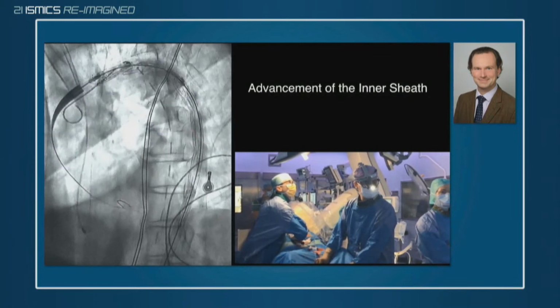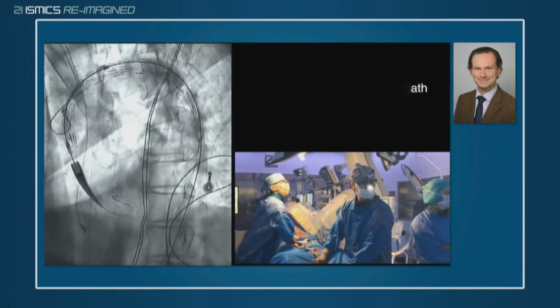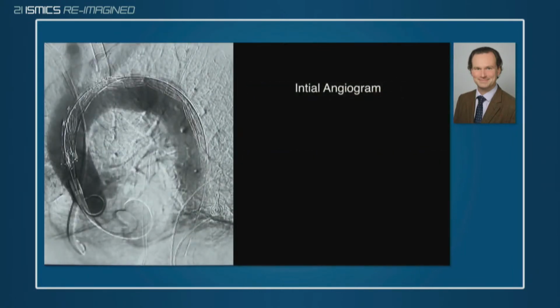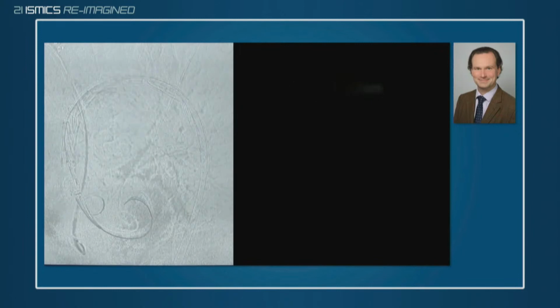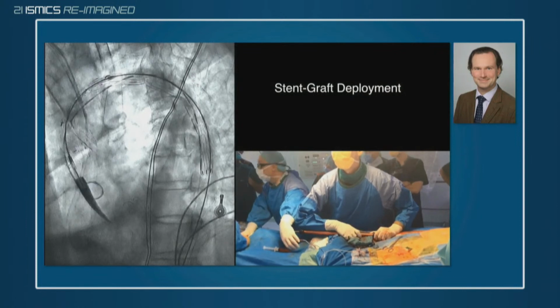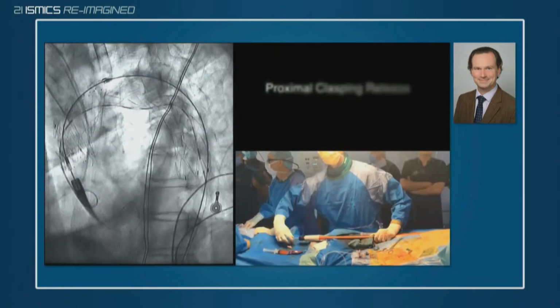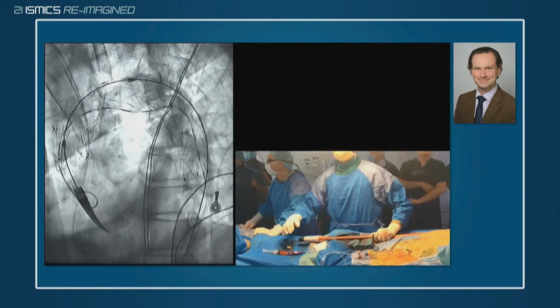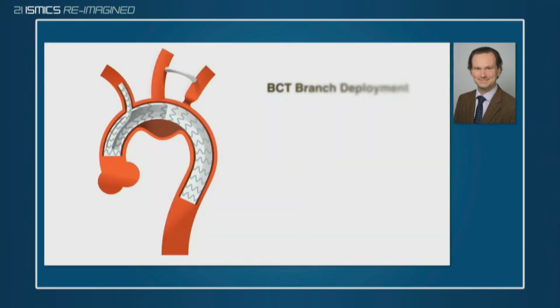The technical detail is that the proximal portion has to be as deep in the ascending aorta as possible to have a very smooth angulation between the window hosting the sleeves and the native supraortic branches. The system has a tip capture which enables perfect stability during deployment of the main body, as you can see here. After release of the tip and deployment of the main body, you have all the time in the world you need to cannulate the sleeves for connecting the bridging stent grafts to the brachiocephalic trunk and to the left common carotid artery, because there is unobstructed free flow through this window.